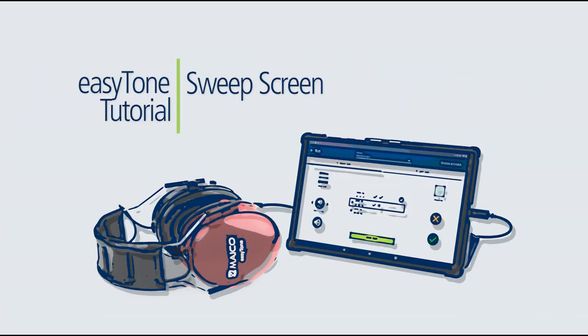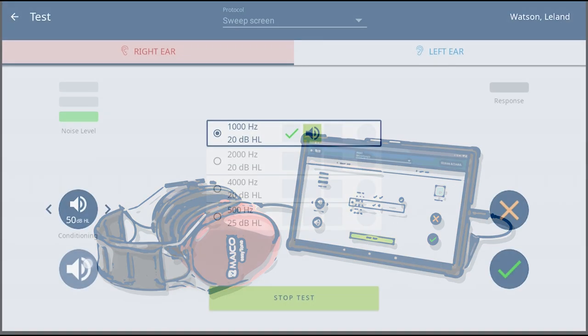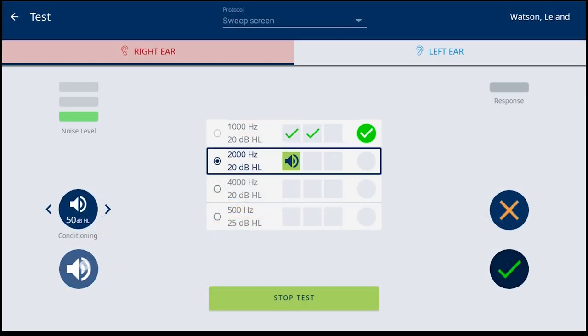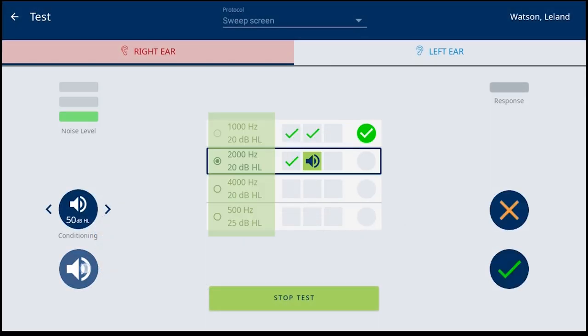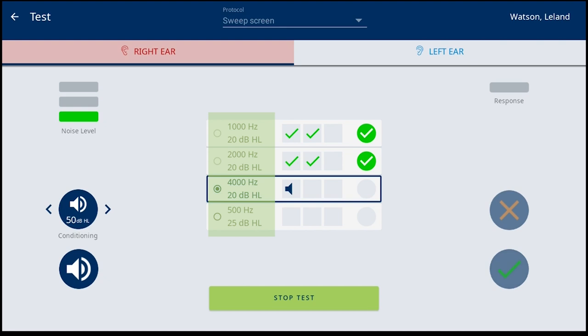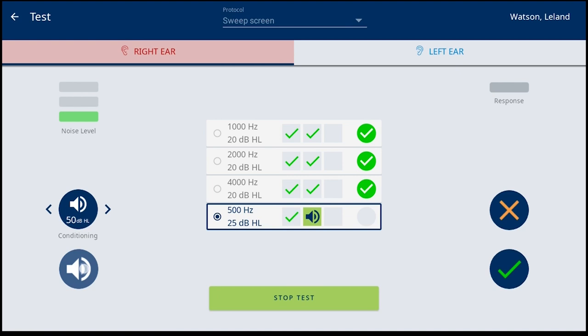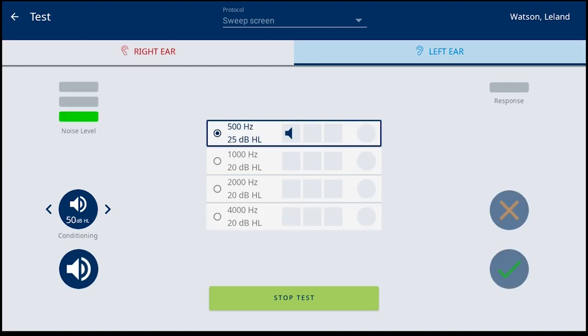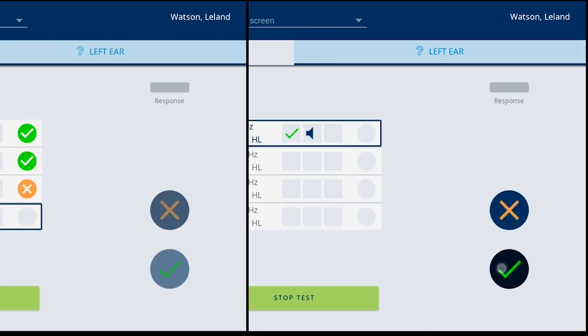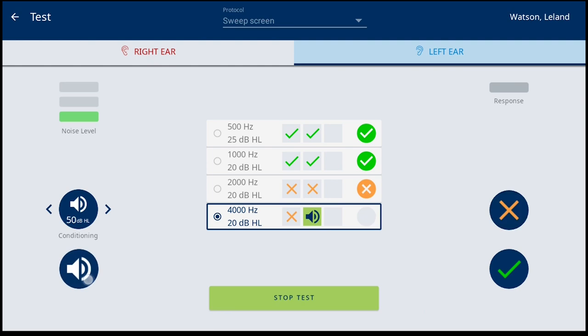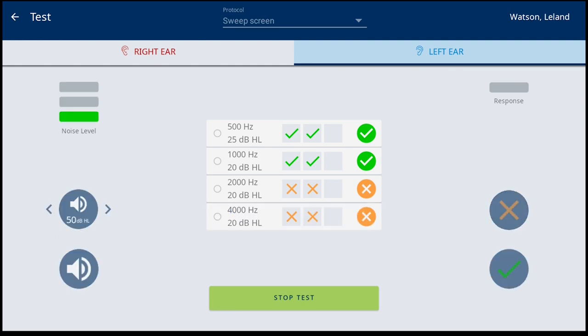One method is a rapid sweep screen. This allows presenting the tones only at the screening level to quickly sweep through the frequencies. This is most widely used in mass hearing screenings to determine those without a hearing issue from those where further evaluation is needed.